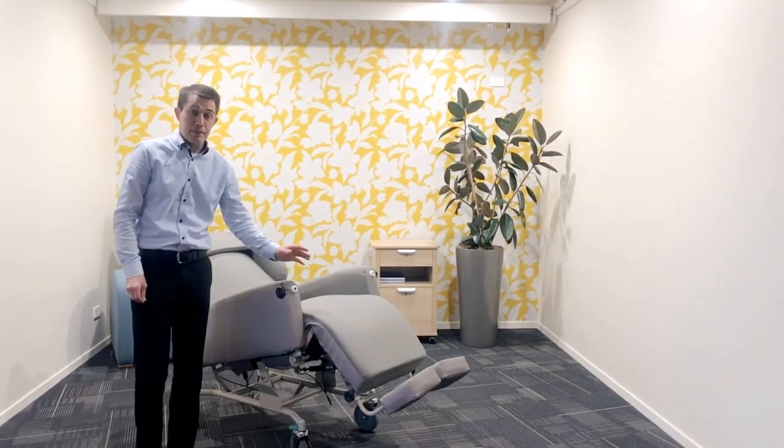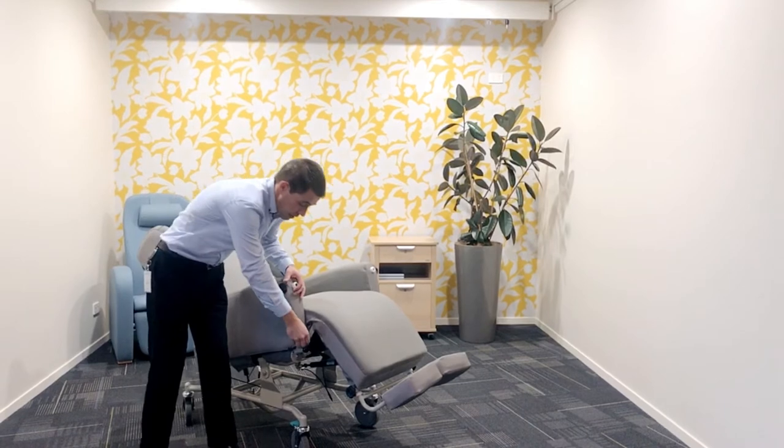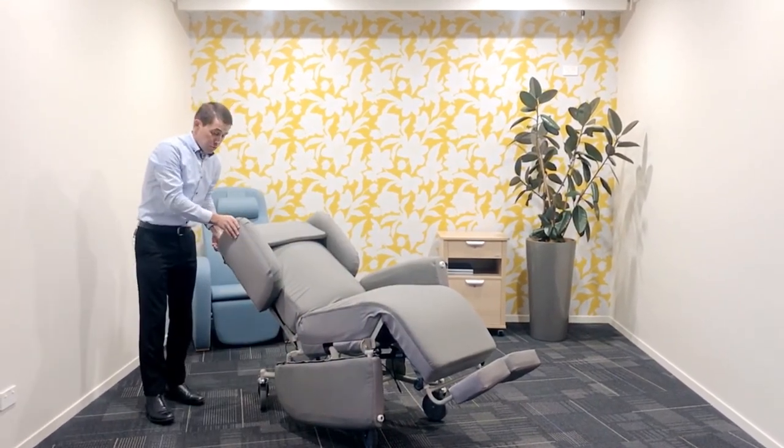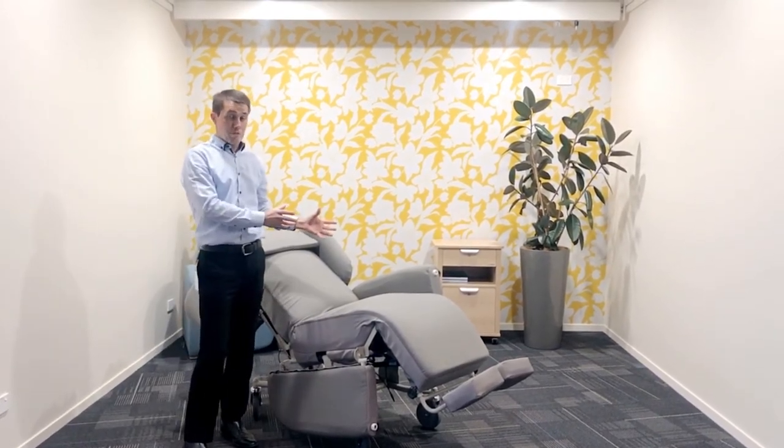Another great benefit with this, in my view, is the ease of transfers. With the arms, you can lower these and the lateral supports to allow very easy hoist access in from this side.